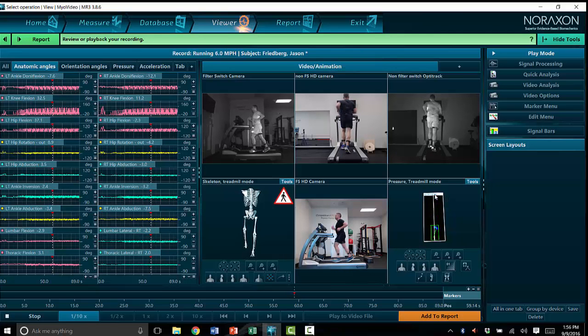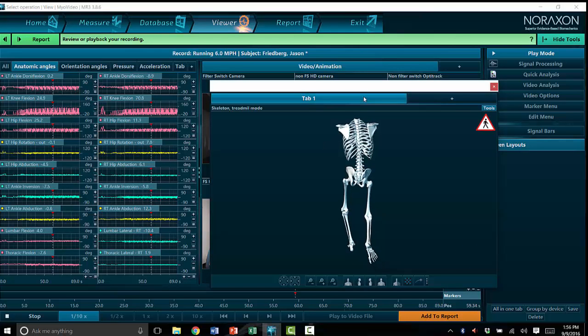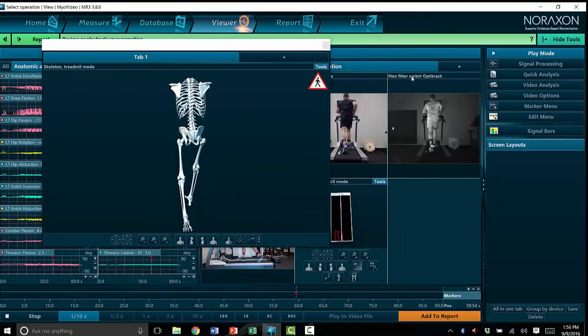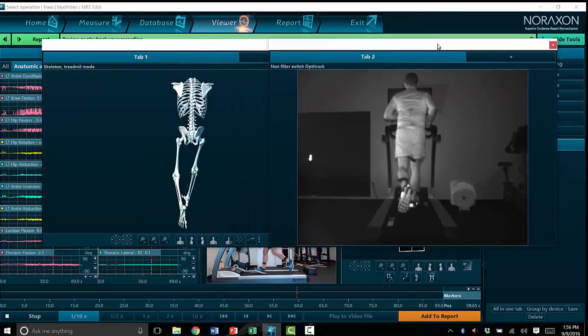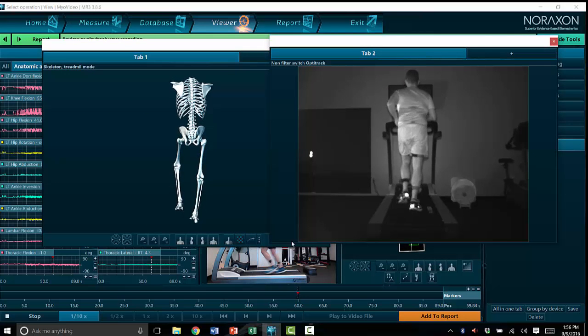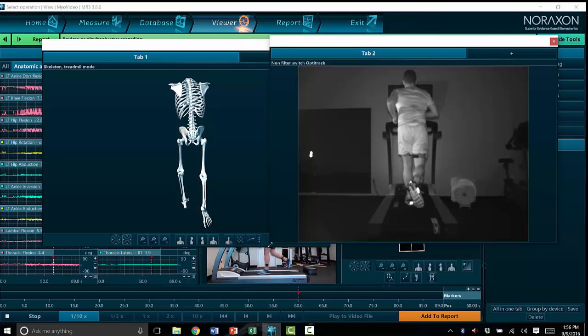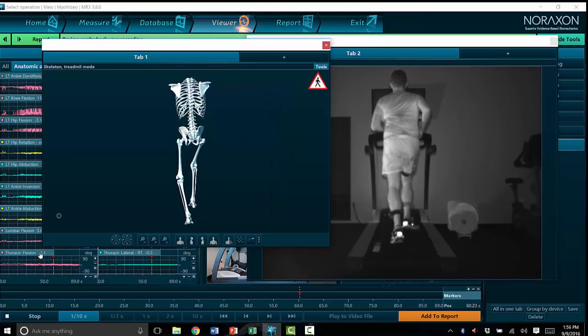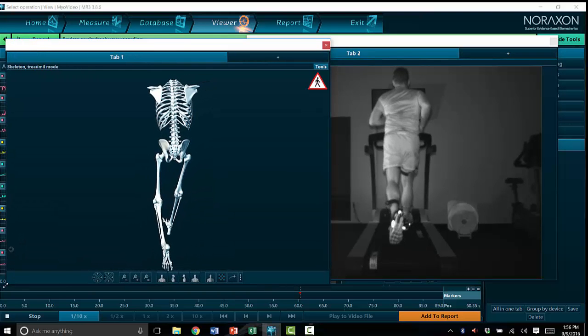For this particular video, we're going to highlight the 3D avatar and we're going to highlight this posterior view so we get a better look at the trunk, pelvis, and knee.